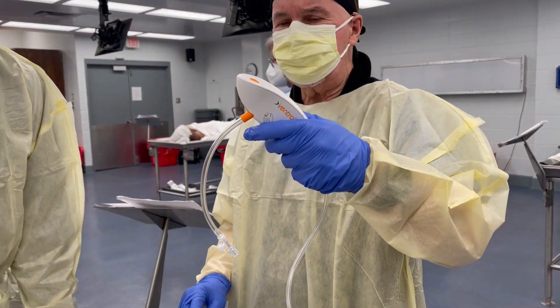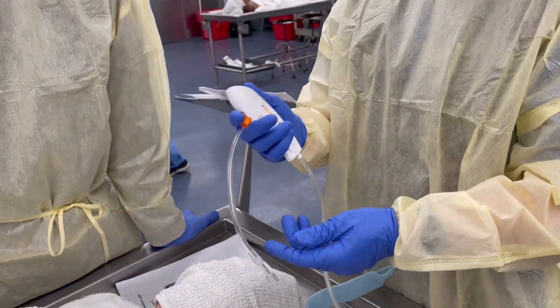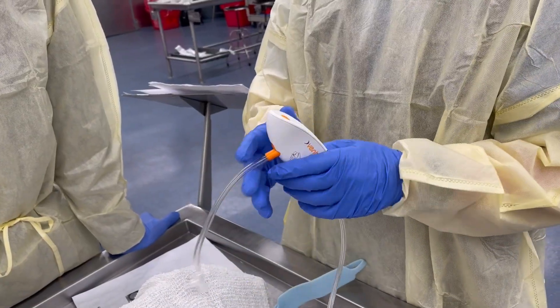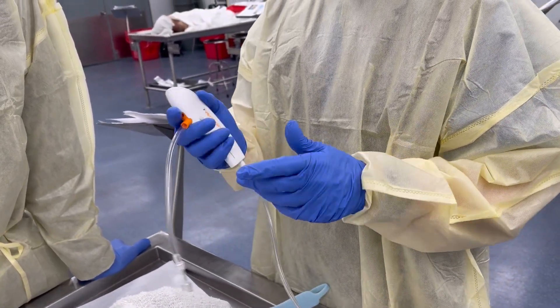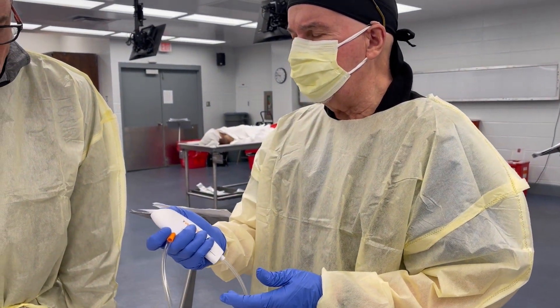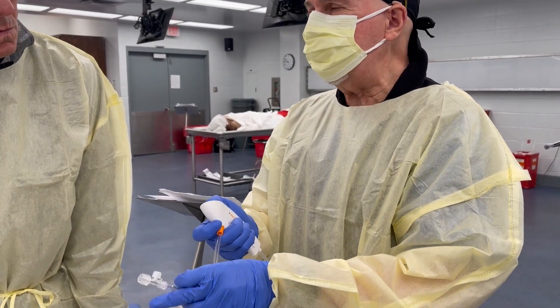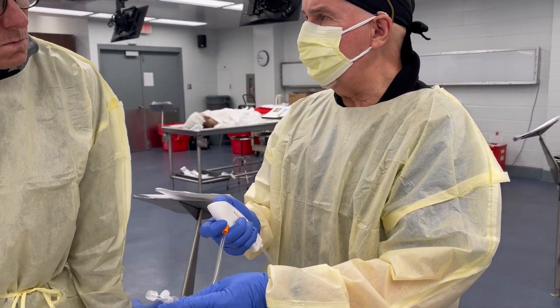The Ventrain device is, I think, perfect for transtracheal jet ventilation. It has the option to actually ventilate the patient, because as you inject air for two seconds at 15 liters per minute, you'll put in — for two seconds — 500 ml.